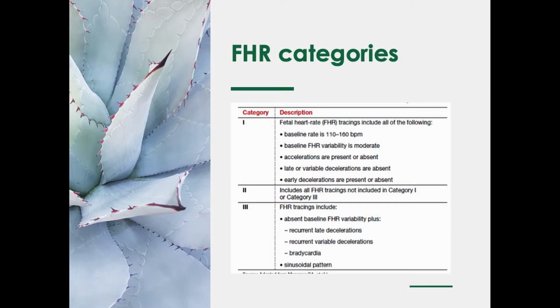So if you're anemic and your fetal heart rate's going up and down in a sinusoidal pattern, the anemia doesn't go away all of a sudden so that you get an acceleration. So they like to test on this. If you see an acceleration in the middle of a sinusoidal pattern, it's almost always considered a pseudo-sinusoidal pattern, in which case we think of narcotic administration causing that.